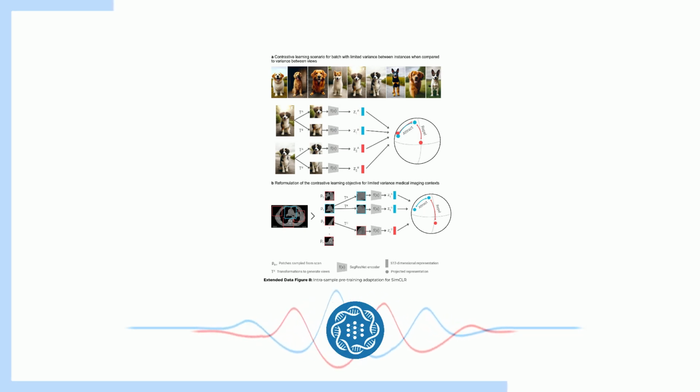And what they found was that similar anatomical structures, things like the heart, the lungs, and bones, tended to cluster together in specific regions of this PCA visualization. So even though no one explicitly told it to, CTFM was automatically grouping organs based on their visual features. Right. That's pretty amazing. Did they take this visualization a step further at all?